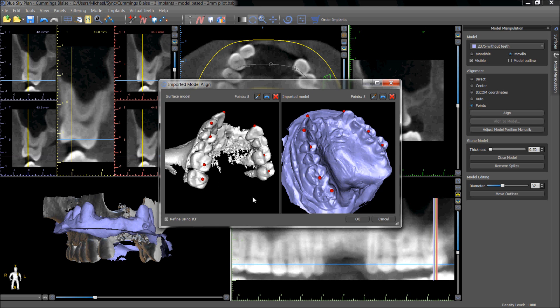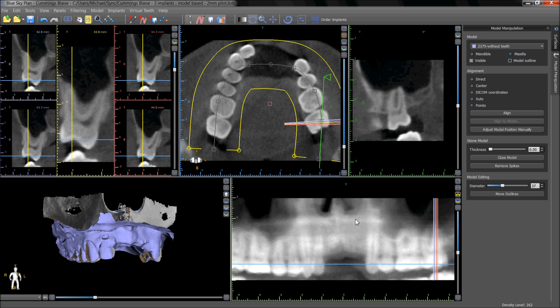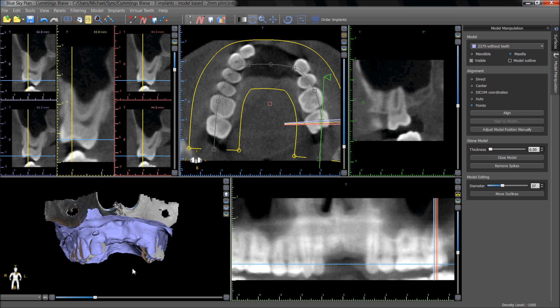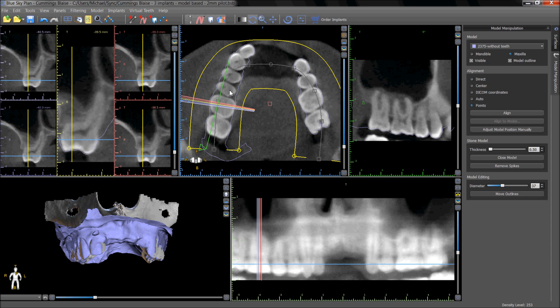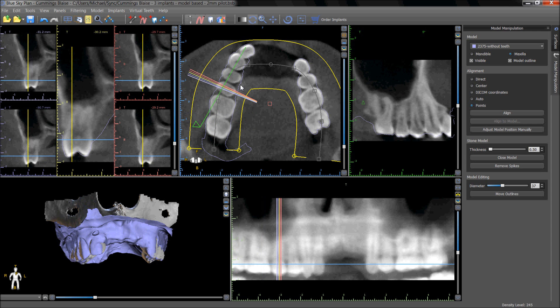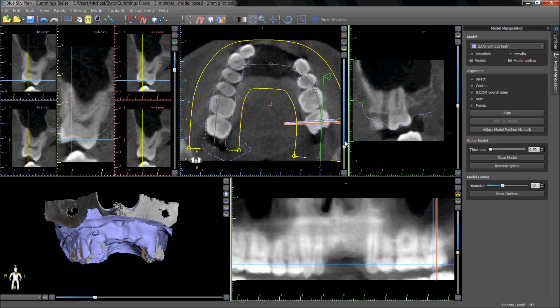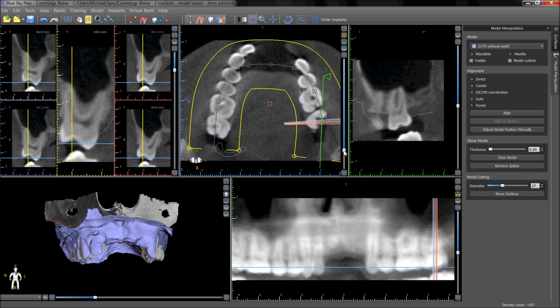Once all the points have been placed, pressing the OK button will complete the merge process. The merge can be checked by pressing model outline and viewing in the cross-sections view that the outline of the imported model goes tightly around areas where there are teeth. It can also be checked by moving the axial view close to the occlusion and confirming that the model outline is wrapped tightly around the areas where there are teeth.